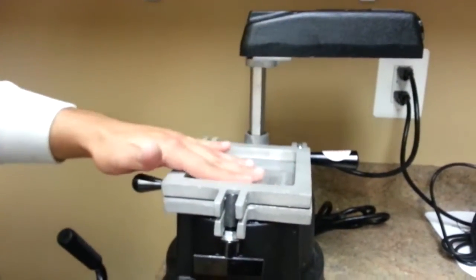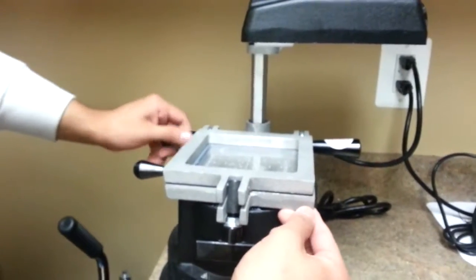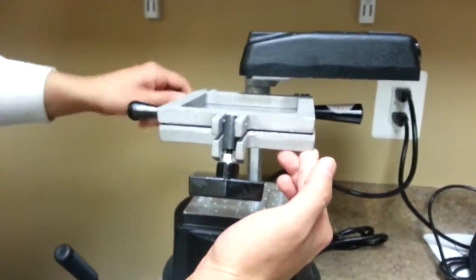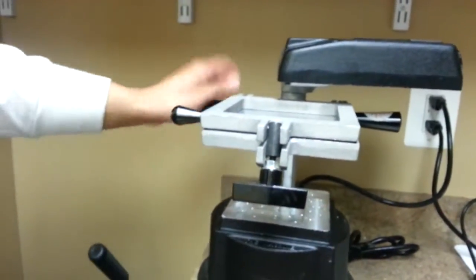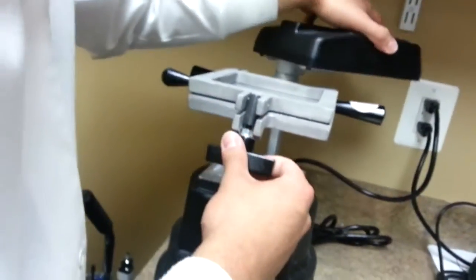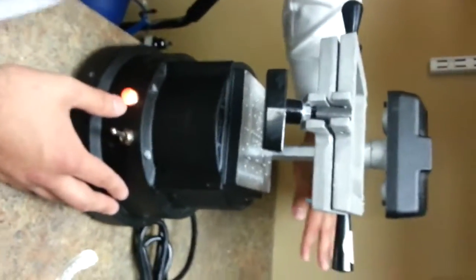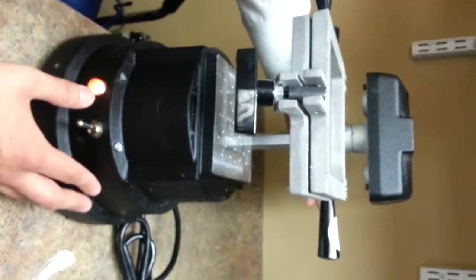Now, the plastic is right here. So, we're going to bring this up. You untwist one of these things on the side, and you bring it up, and then you twist it back up. Okay, so now the heater should be going on right now. Try to make sure that there's no cables or anything underneath the heater while it's heating up. It usually takes about 30 seconds for it to heat up.